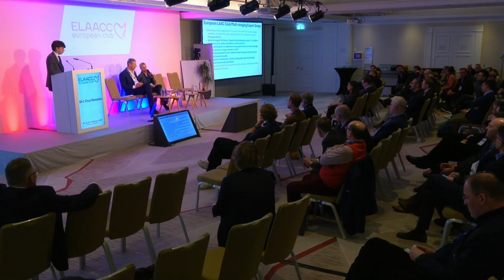And Jens Erik, if you contribute to REDCap, we'll collect data from ICE cases and data from TE cases, and we might come to some solutions or insights. So is there consensus that we don't need a study for that? Who thinks we need a study to compare mini TE and ICE? Okay, there's consensus.